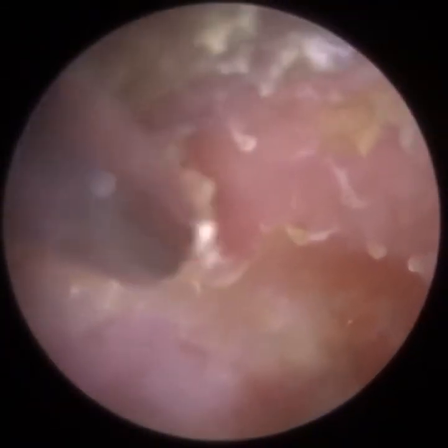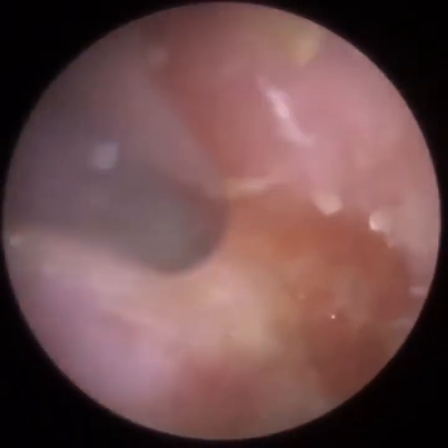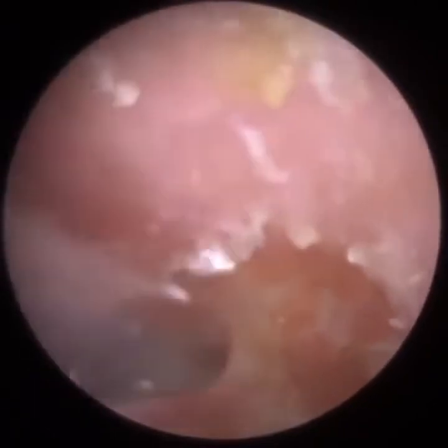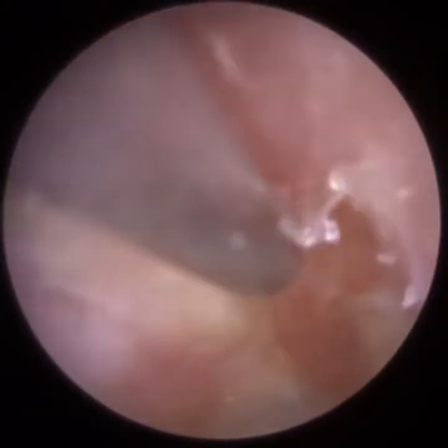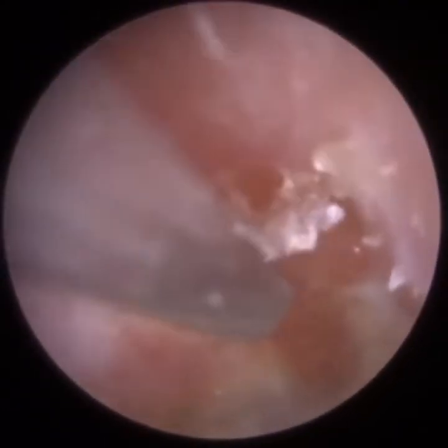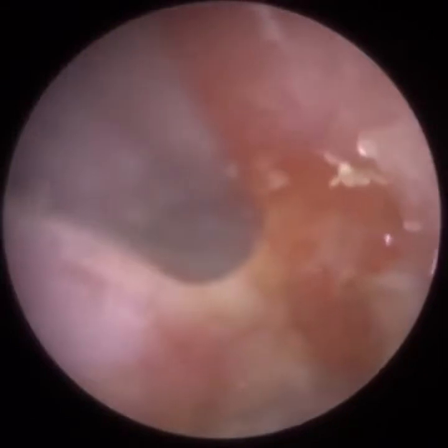So I've just reattached the fine end gauge. We're going to approach the skin on the roof of the ear canal, and we're going to peel it downwards off the eardrum, hopefully as much as we can anyway. Now sometimes the skin is half dead, it's semi shedding, so it's dying but it's not yet dead, and it still therefore has strong adhesions to the eardrum, so it's just not quite ready, and we have to accept that. We don't continue.